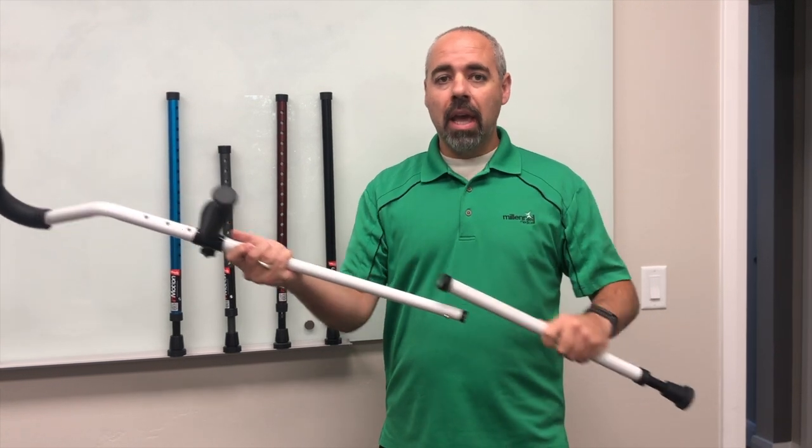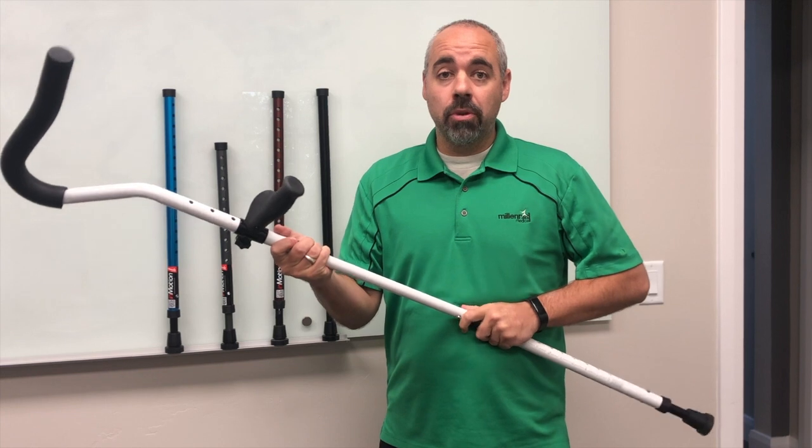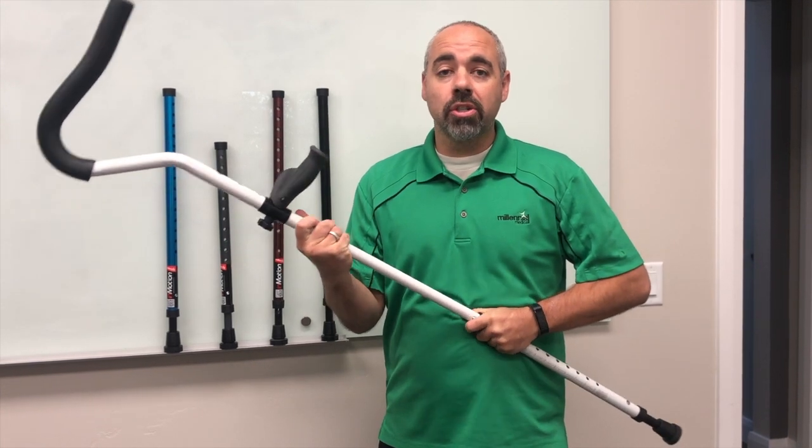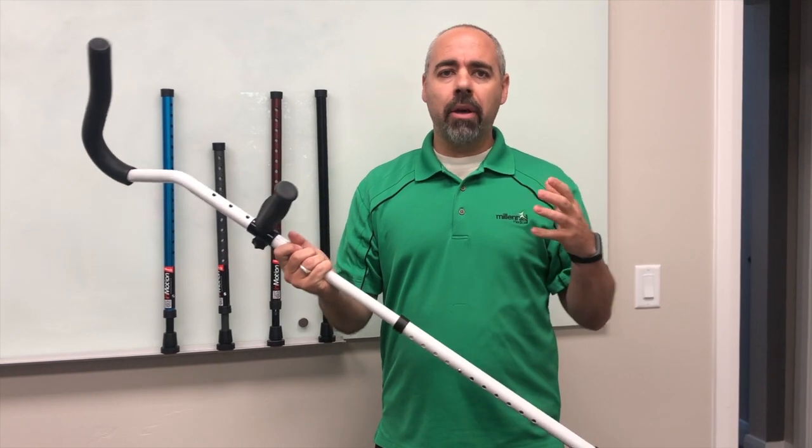Put it back on, and what happens is you're getting a very even balance and distribution of weight and pressure on those crutches — just like car tires need to be rotated four ways.